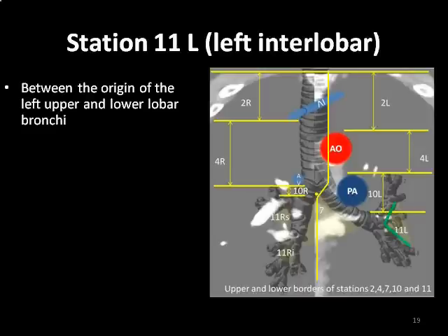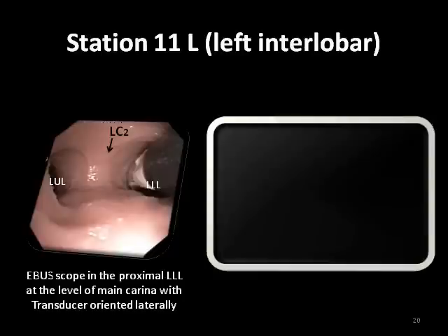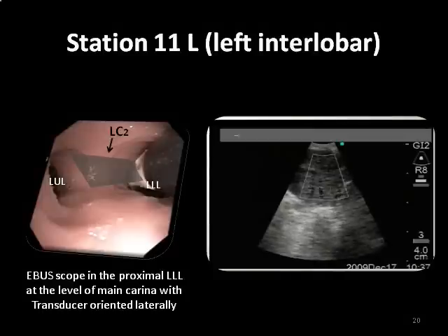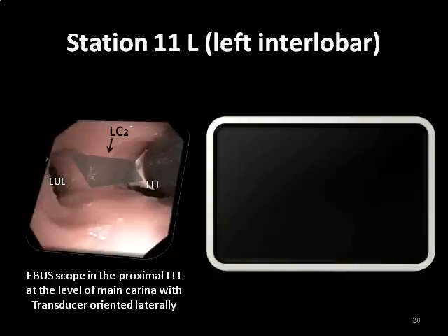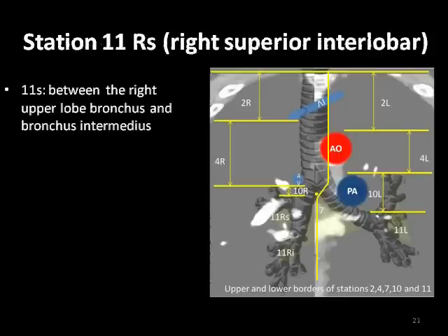Station 11L is comprised of nodes located in the region between the origins of the left upper and lower lobar bronchi. To visualize hilar Station 11L, the scope is advanced towards the proximal part of the lower lobe bronchus, with the transducer oriented laterally towards the left in order to scan for interlobar lymph nodes. In this example, the lymph nodes and lung parenchyma are visualized, but depending on the exact position of the node and scanning orientation, interlobar vessels may be seen as well.